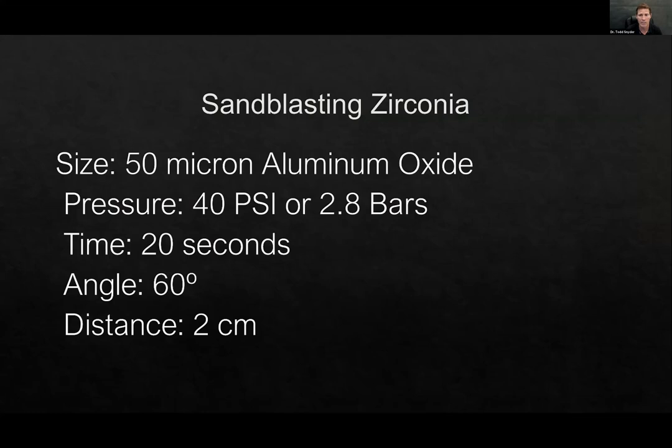In other words, we don't have to etch the zirconia because the etching doesn't work. The zirconia has to be air abraded. So a lab's doing that for you typically. Just make sure they are. You want to double check with them.